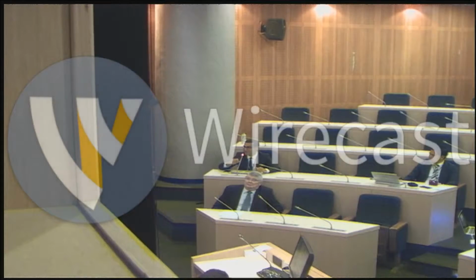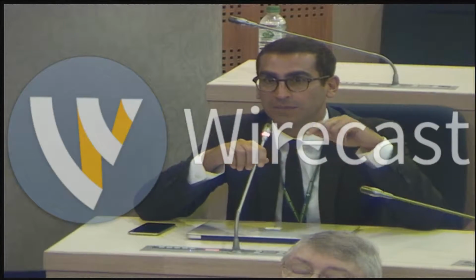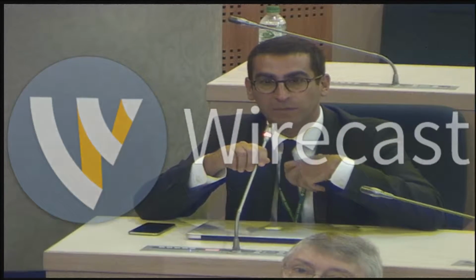Thank you very much for this very excellent presentation. In my experience, for the beginner, I also use the Flush Knife because my mentor, as I told you, is Professor Toyonaga. But I think a knife with injection is very useful, and some studies show that the duration of the procedure is perhaps shorter. We can discuss these publications.